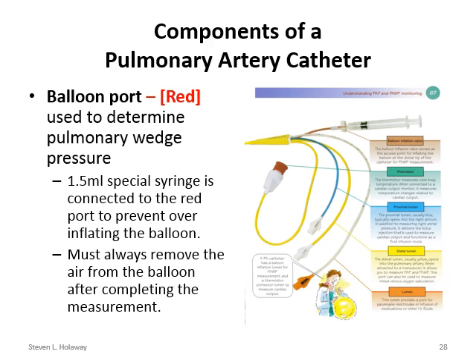This particular one has a slide lock up here, you can see, and it's got red lines. When the red lines line up, it's open. You can push air in or take air out. What you want to see basically is the lines being not connected. When it's not connected, it's locked. So typically in normal situations, the lines should not match up. There should not be any air in here, and there should not be any air in here. That's just a safety feature that you want to do to make sure there's not any air in there.